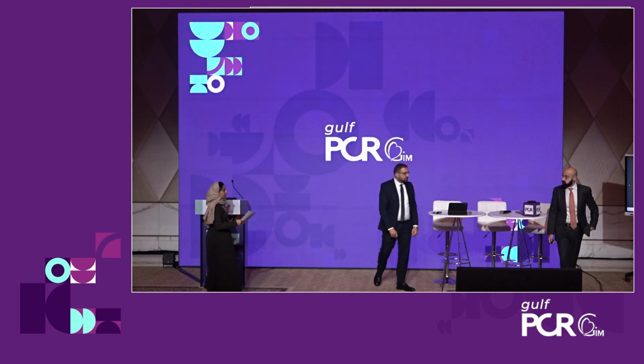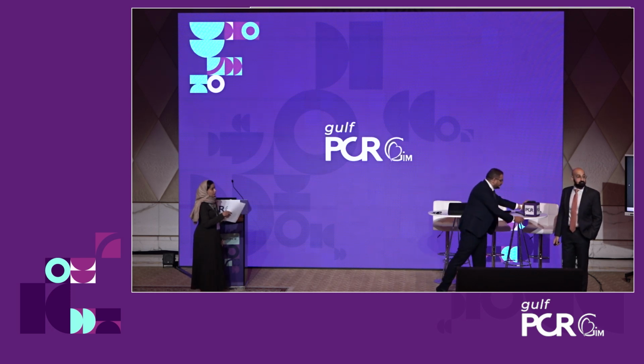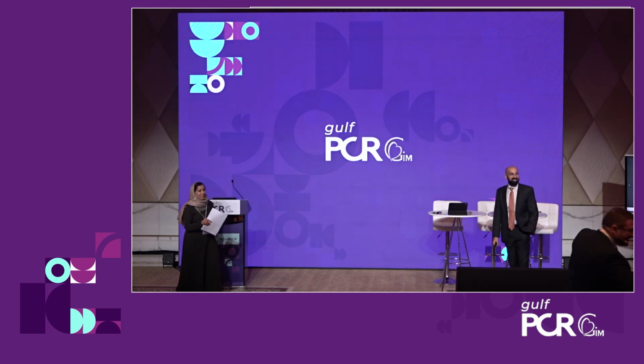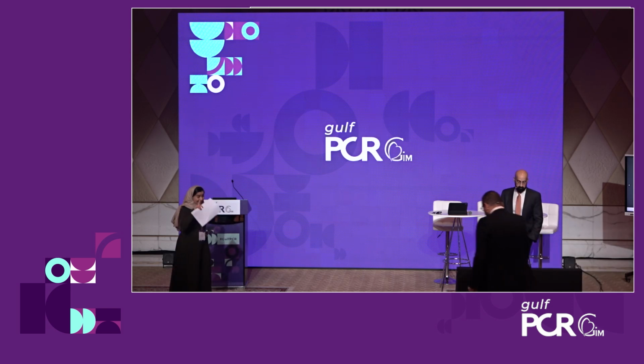Thank you so much. I want to know about the tension on the wire, Safari wire, when deploying the valve. Is it necessary to have pushing on it to be at the greater curvature, or is the neutral position okay? What's your experience or suggestion?